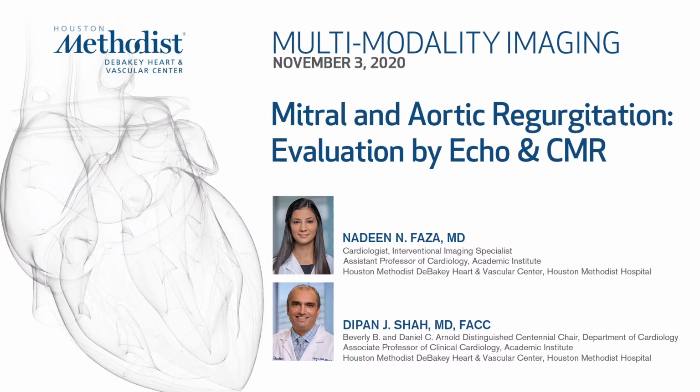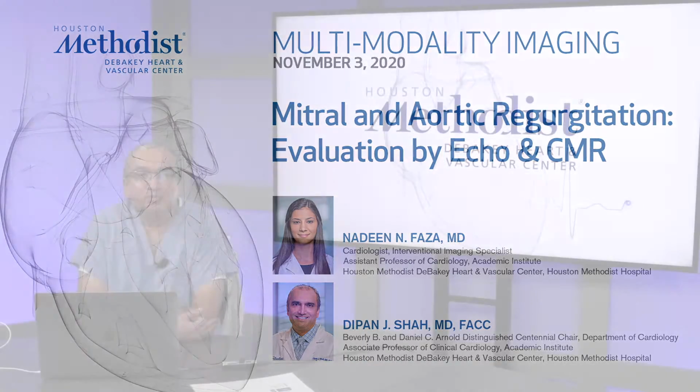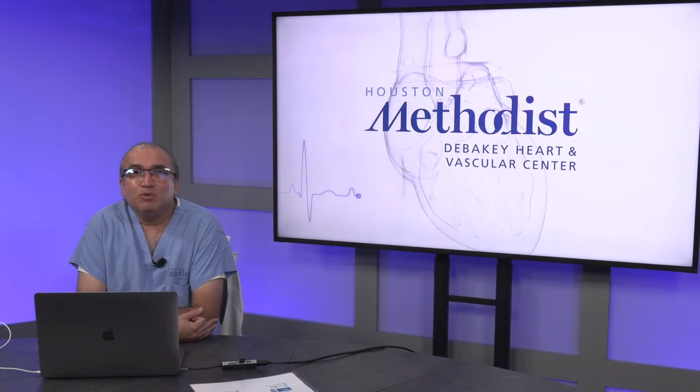I'm coming to you from the DeBakey studio live, and with me is Dr. Nadeen Faza, who's one of our structural heart interventional imaging colleagues and an assistant professor of medicine. Today, we're going to be speaking with you about mitral and aortic regurgitation evaluation by echocardiography and by CMR.